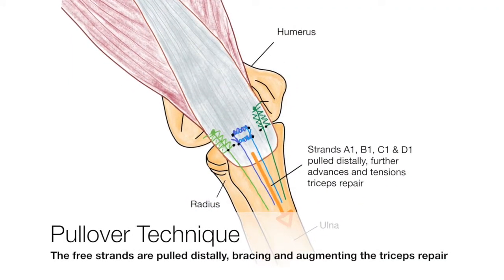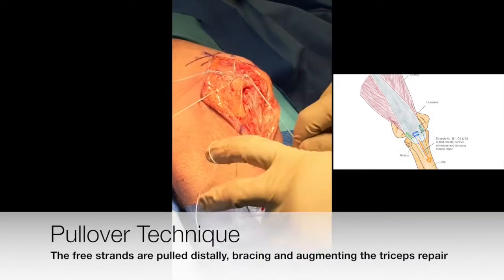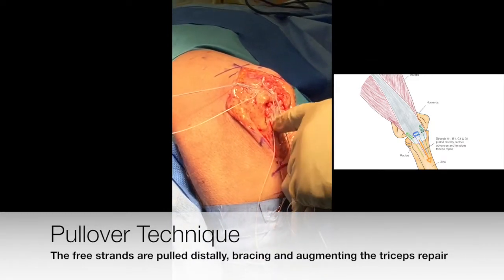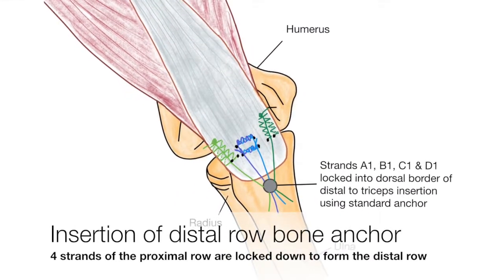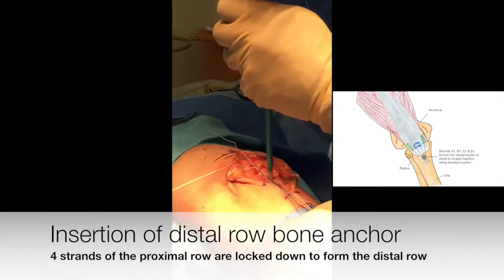The pullover technique is then performed. A strand is taken from each of the knots and pulled distally, further advancing and bracing the repair. A simple bone anchor is then used to lock the strands to the ulnar, just distal to the triceps footprint.